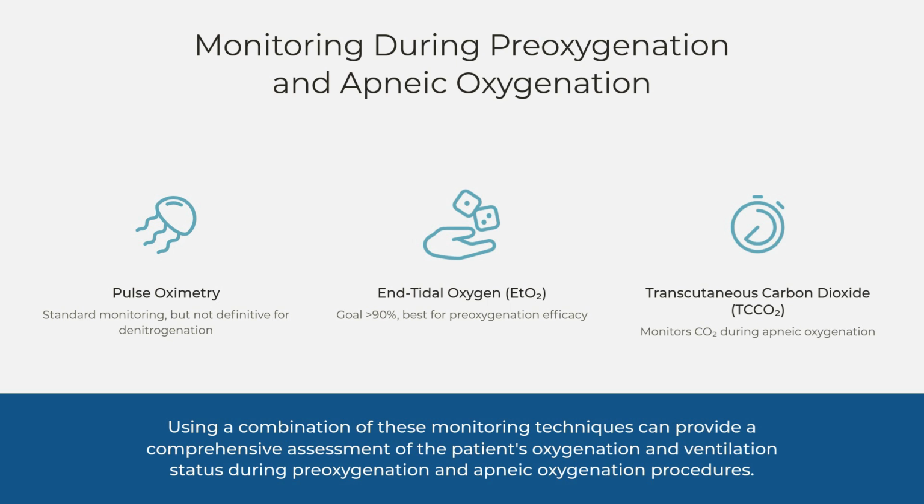During apneic oxygenation, transcutaneous carbon dioxide monitoring, or TCCO2, helps track CO2 buildup, especially with high-flow nasal oxygen, where end-tidal CO2 isn't measurable, alerting us to hypercarbia risks. These are a few tools that can be utilized to aid in monitoring if they are available.